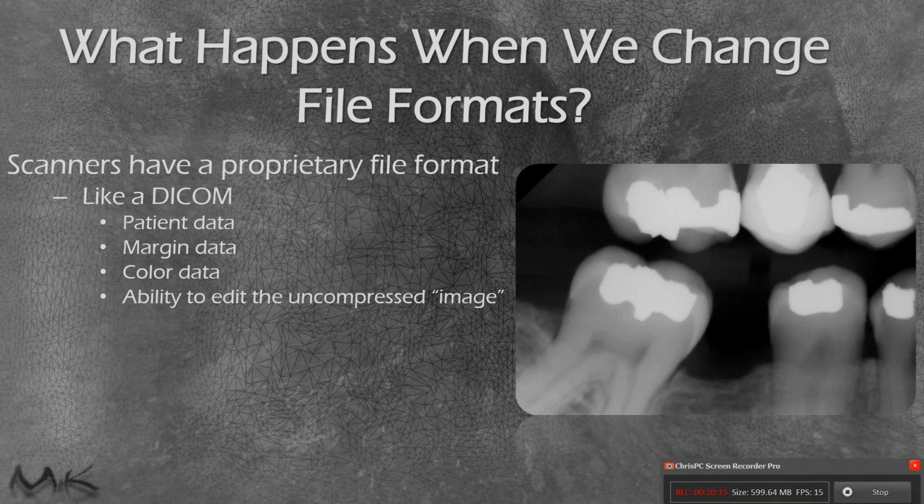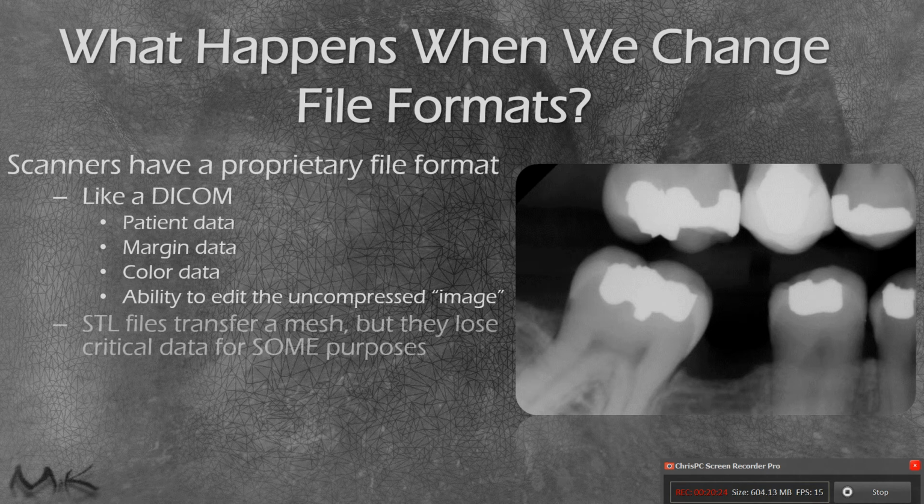If we want to make changes to our digital files, one of the best ways to do it is in our digital scanner before we send it off to create a 3D printed product. So we have to understand that you lose some critical data for some purposes.